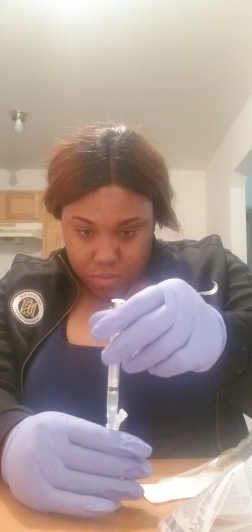This is a syringe. Now, right here is the barrel, and this is the plunger. So barrel, plunger. You want to know your syringes. That's the syringe. Now that's a syringe with a needle. Now this is the hub right here, and this is the tip of the needle.